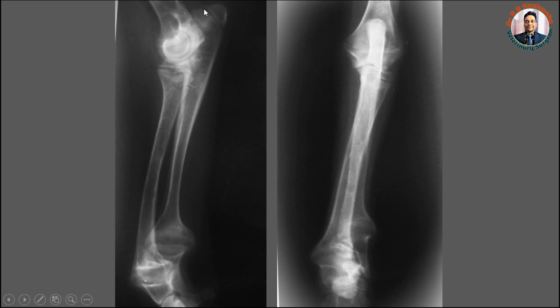You could see here, there is a radiolucent line which indicates that this is a young animal. This one is the proximal extremity of the radius. This one is the diaphysis of the radius and this one is the diaphysis of the ulna. Here in the dog, this one is the styloid process. This is the epiphysis and this one is the metaphysis. Here this one is the metaphysis and this one is the epiphysis.